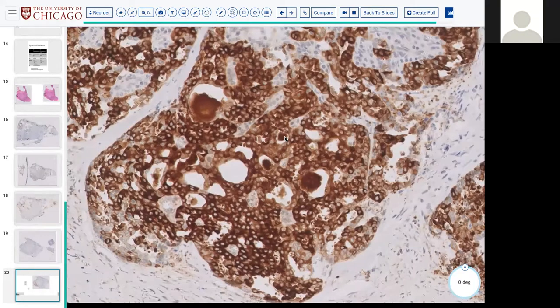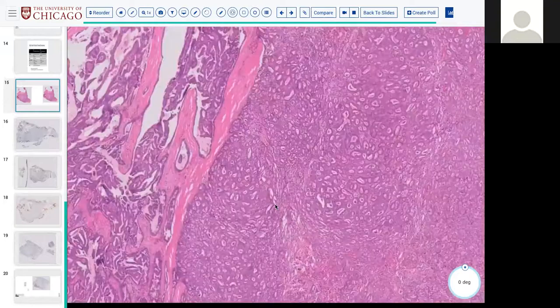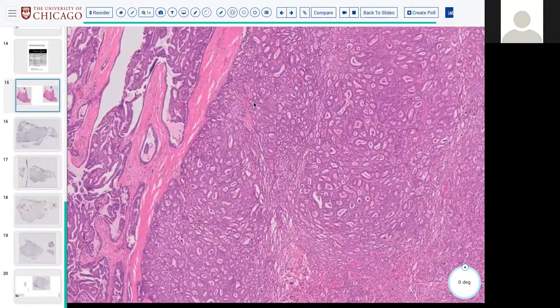There is a variant of salivary papillary-like with a mammary something. Mammary analog secretory carcinoma. Yes, yes. So this is a secretory carcinoma of salivary gland type that is primarily originating in the thyroid. And the two types of salivary carcinomas that are known to originate in the thyroid are secretory and mucoepidermoid. So you can get those two types of salivary tumors primarily in the thyroid.